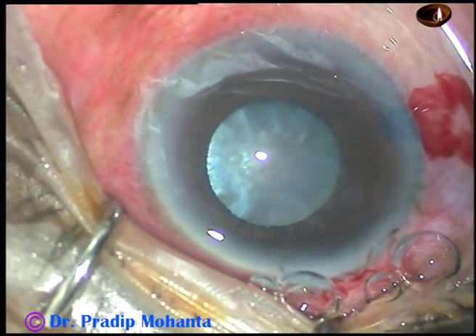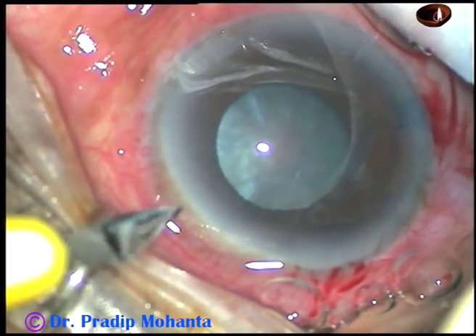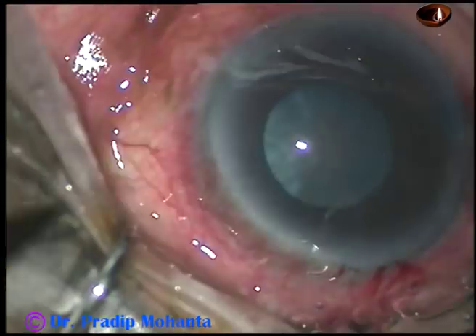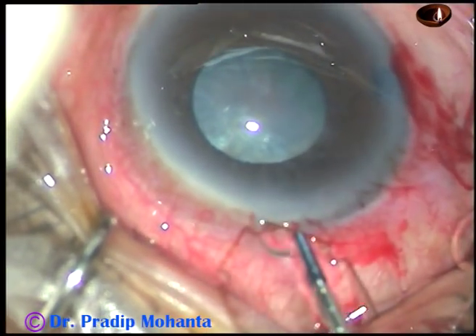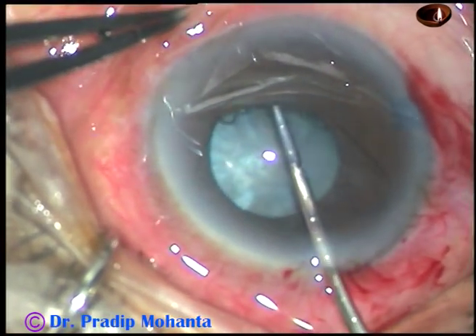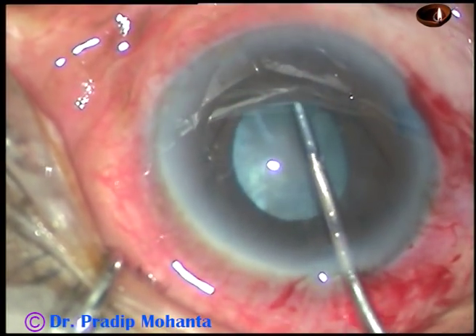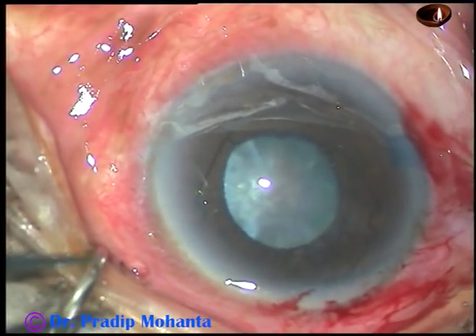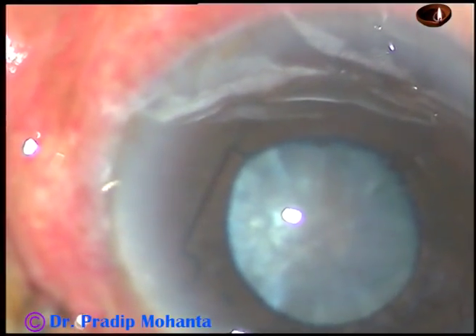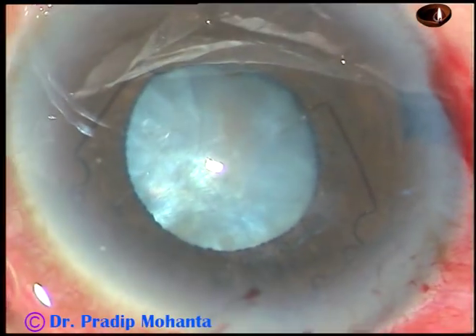The anterior chamber is filled with viscoelastic substance. This is another paracentesis on the left side of the main incision. And this is the B-hex. If the device goes totally into the anterior chamber, we can tuck the leading flange at once. But if it doesn't go into the anterior chamber completely, we must place it first in the anterior chamber, then tuck the flanges.